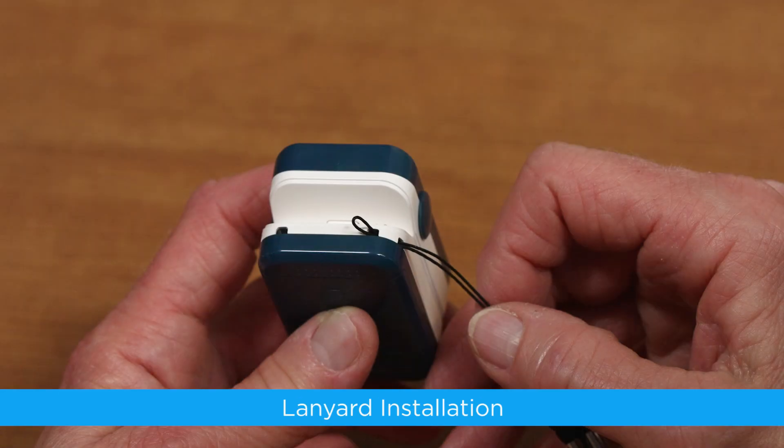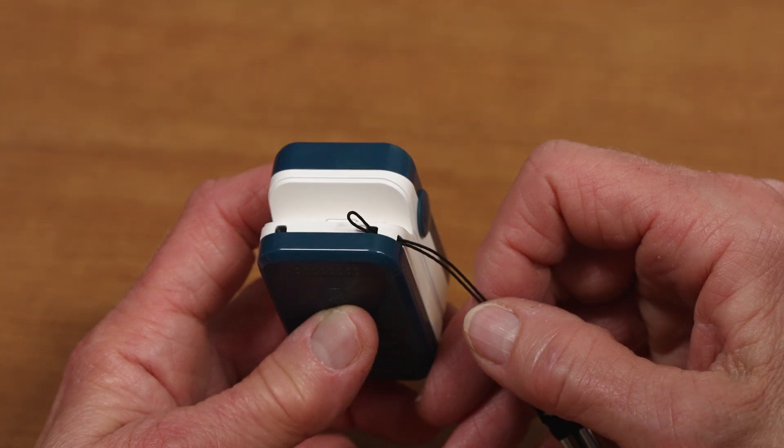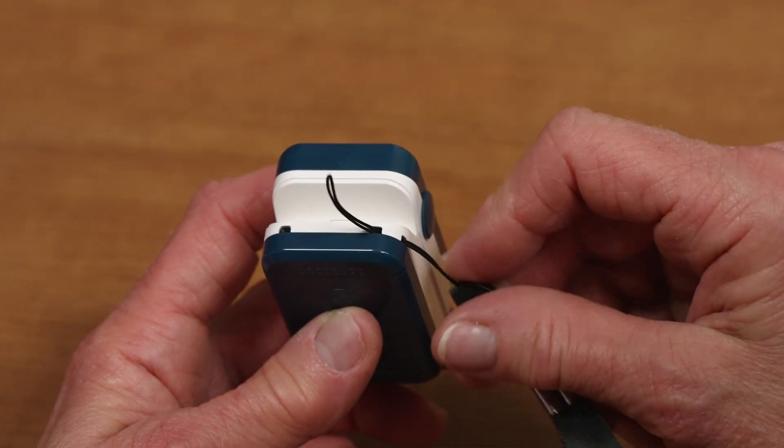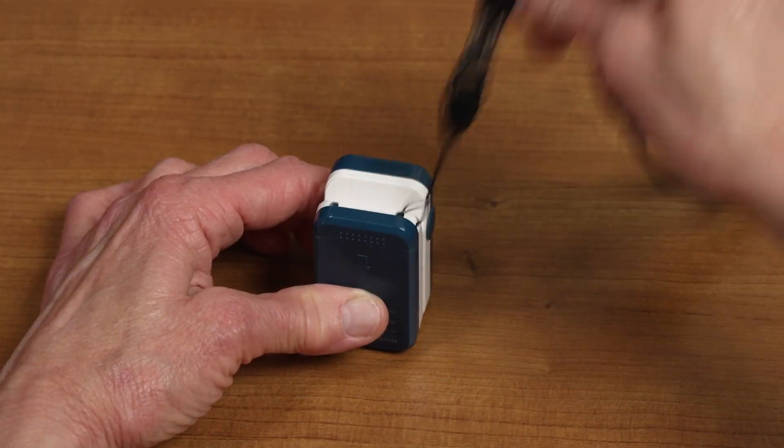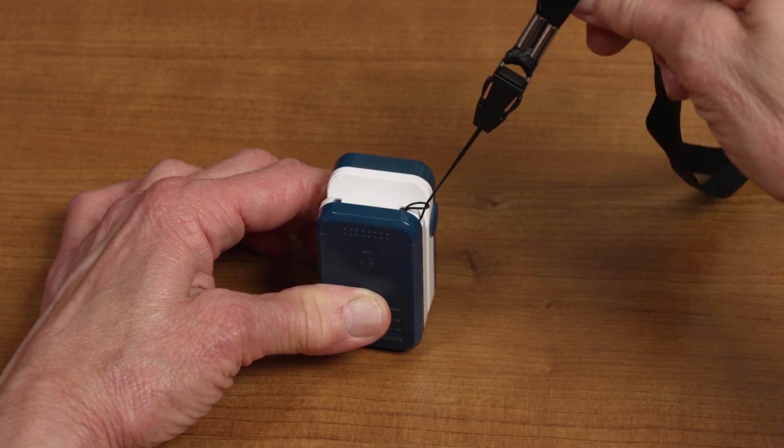Lanyard Installation. Thread the thinner end of the lanyard through the lanyard hole located on the bottom corners of the meter. Then, thread the thicker end of the lanyard through the thinner end of the lanyard. Pull the thicker end of the lanyard until it's tight.